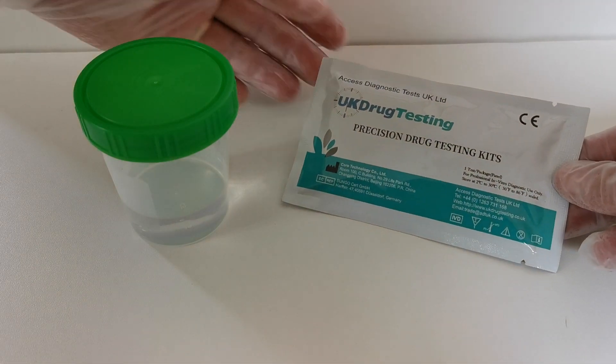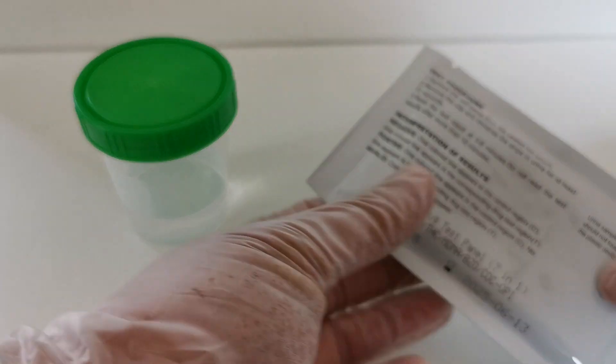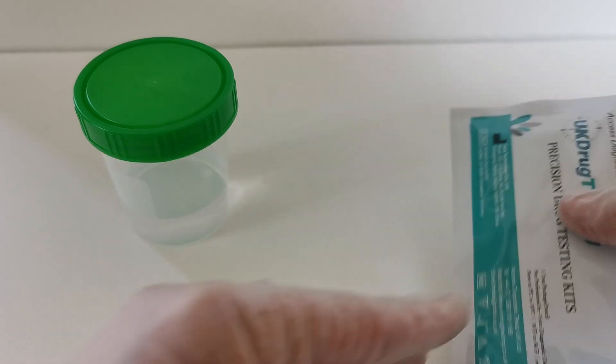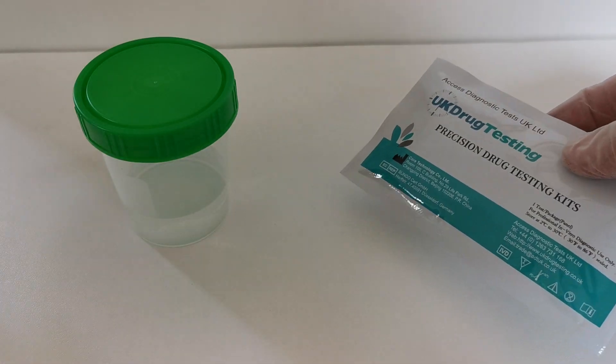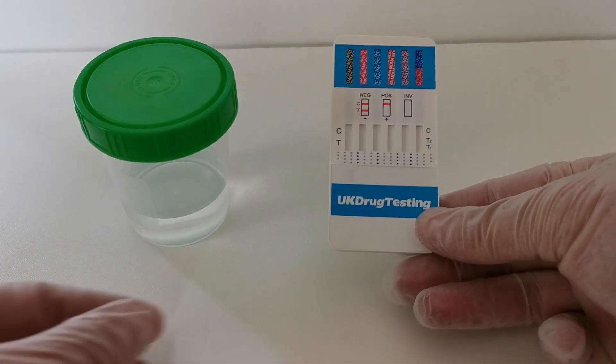This is the packaging that they are presented in. Most drug tests will come delivered in a foil. Some will have instructions on the rear, others may not. Once it's opened, what you get is a little bag of desiccant and a panel drug test as you can see here.